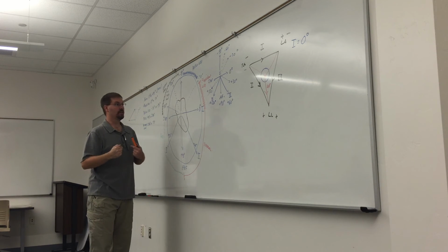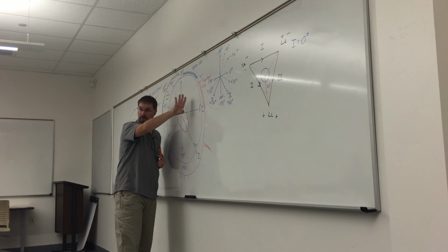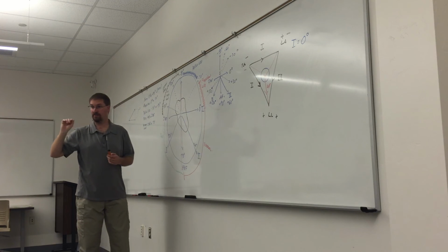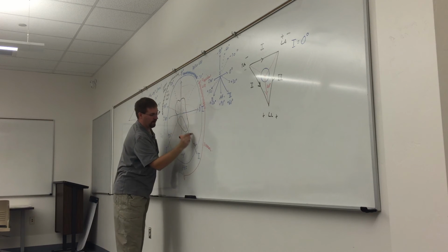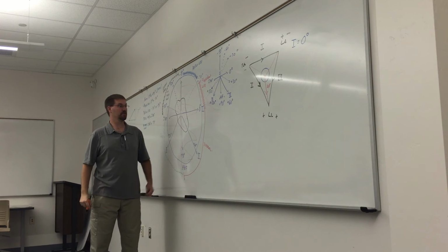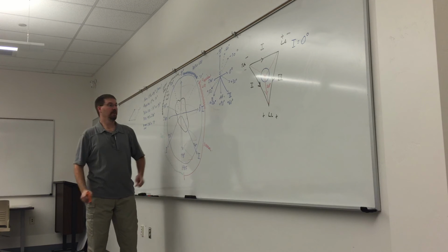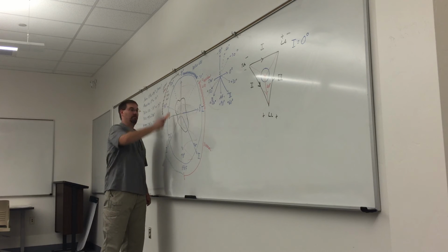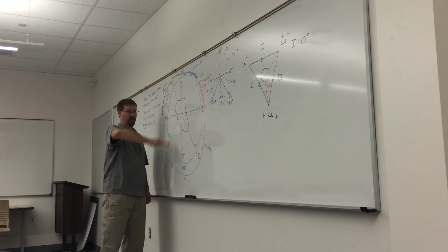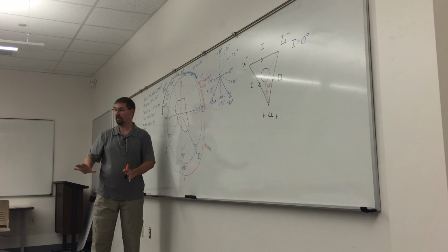It's up. So if it's up, it's moving to the positive electrode in this direction. Just by looking at lead 1, if lead 1 is up, then my axis is going to be somewhere on this side. Are you guys cool with that? Everyone, so far so good? If lead 1 was negative, my axis would be on the other side, somewhere potentially over here. So I just cut my circle in half by looking at lead 1.